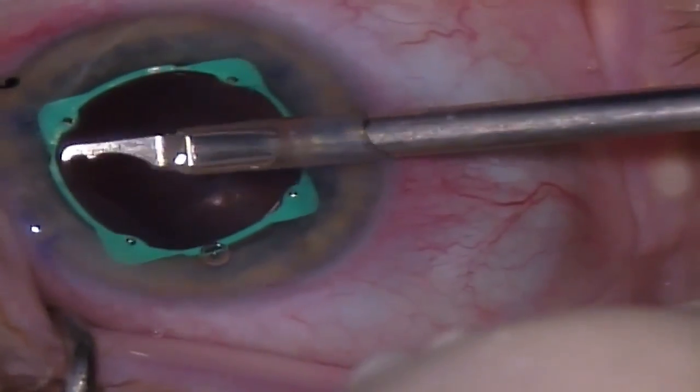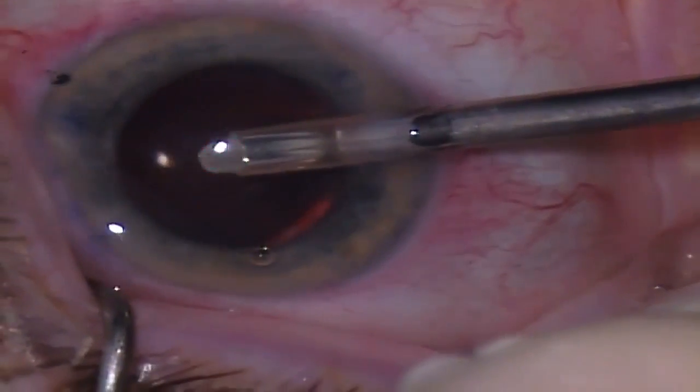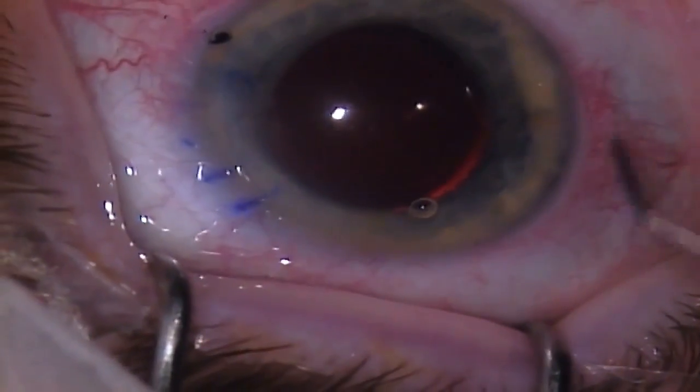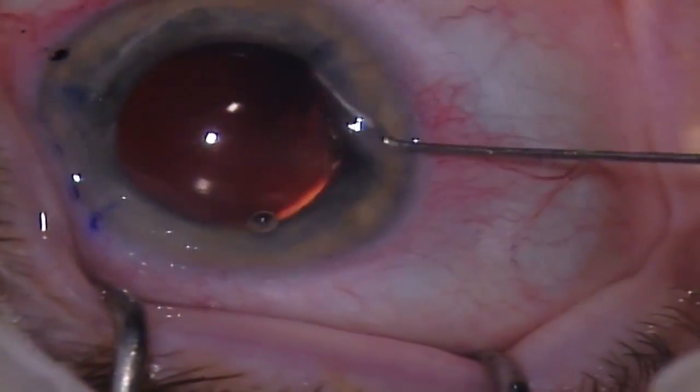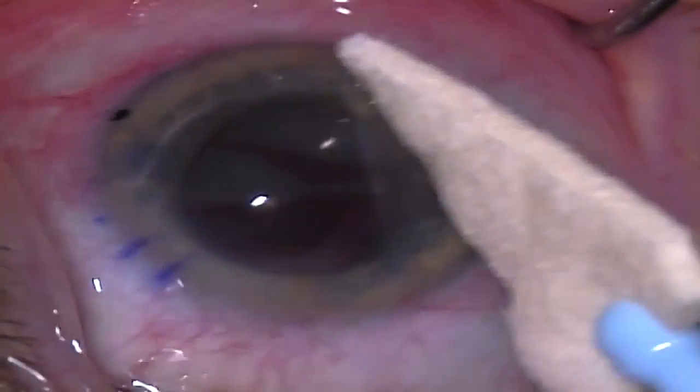I remove the eye ring by using the injector to grasp the beam at the notch and pulling inwards. This technique is known as the backflip and allows for removal without first disengaging the channels or otherwise manipulating the ring. Please note at the end of the case that there has been no damage to the iris or pigment loss.